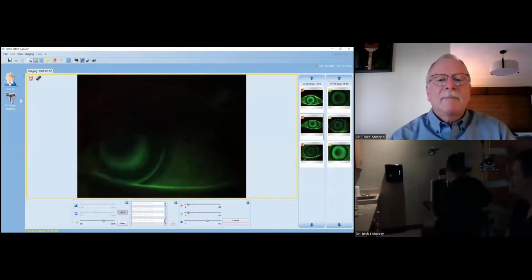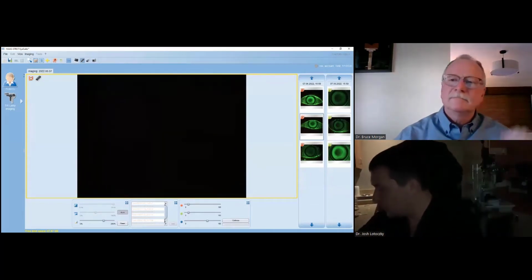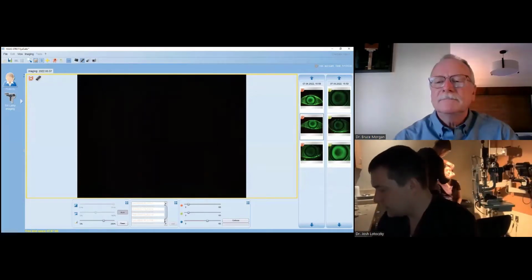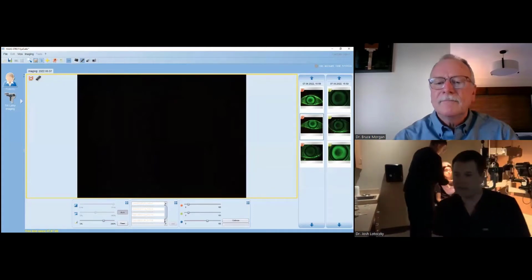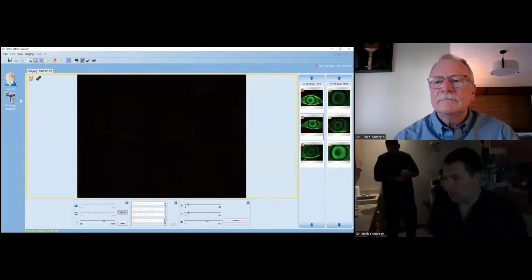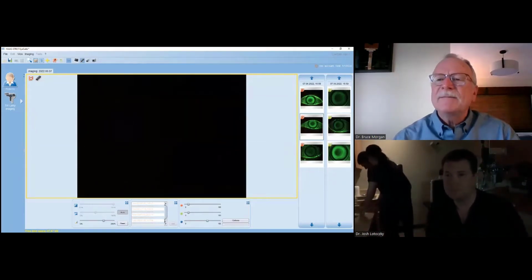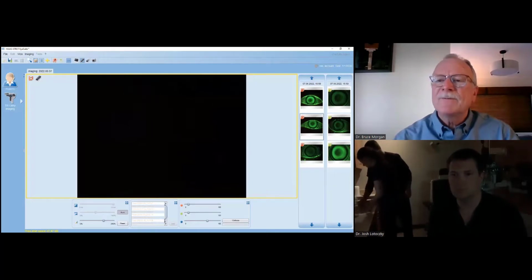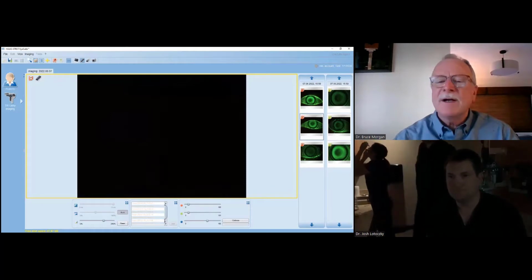So, all right, we're going to try another lens. While we're getting ready for that, Dr. Morgan, was there anything that you wanted to go through or questions you've seen come through that pertain to this? I know I started talking about our schedule. I've got a few slides on that later on as far as follow up and how we treat uncorrected myopia in that first week or two, but I think those are important things to talk about.